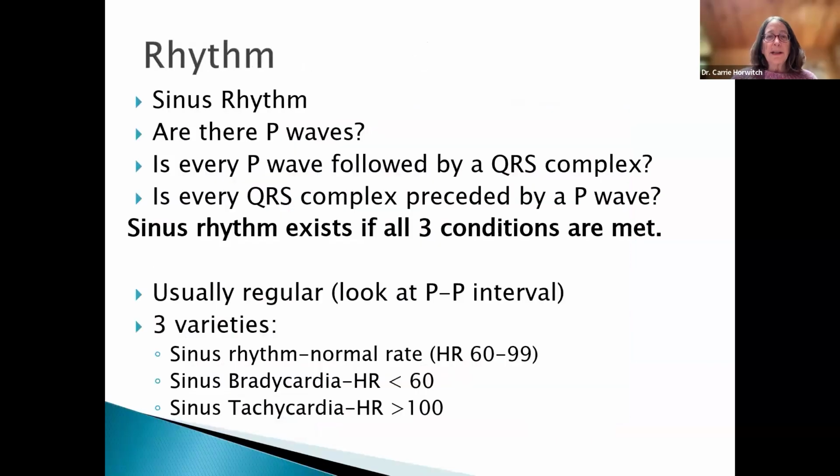Okay. The next thing we're going to look at is rhythm. And here is where we need to determine, is it sinus rhythm or not? So again, these are really basics. There are several other lectures from one of our cardiologists through MAVEN that go through a lot of different arrhythmias, bradyarrhythmias, tachyarrhythmias, as well as other EKGs. And you can also get tutorials in EKG reading if you want. So please reach out to MAVEN if you want additional discussions on EKG.